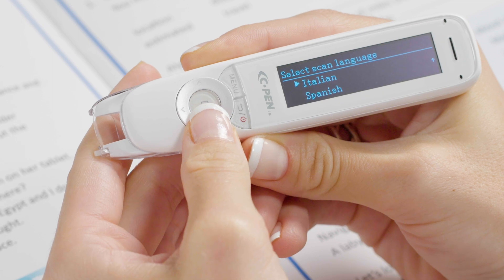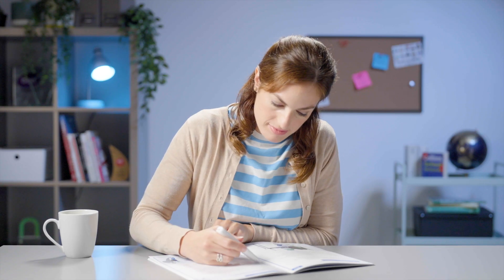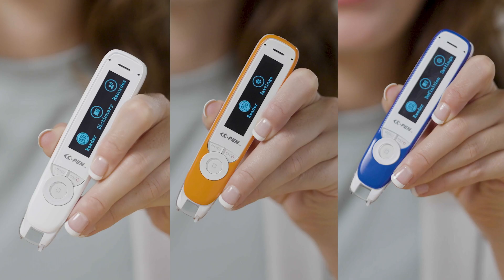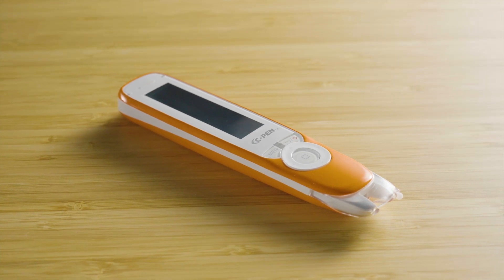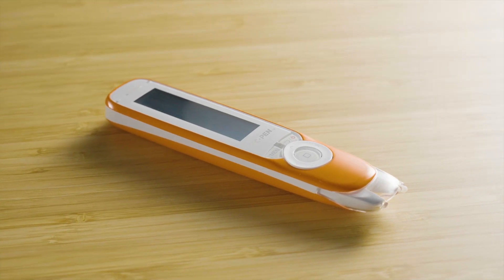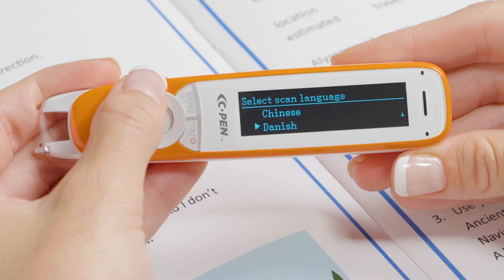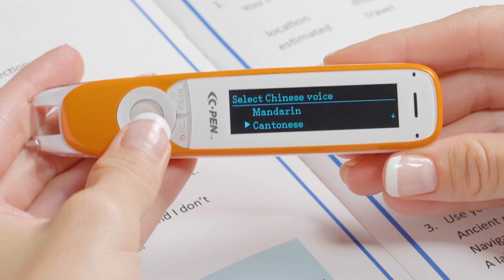Text Language selects the language your device will scan and convert into speech. These will be the same as the menu language options you have available on your device, with the addition of Chinese and Norwegian for the Exam Reader 2. Once you've selected the text language, for certain languages you'll be given an extra option to adjust the accent or dialect. This can help with clarity and comprehension.